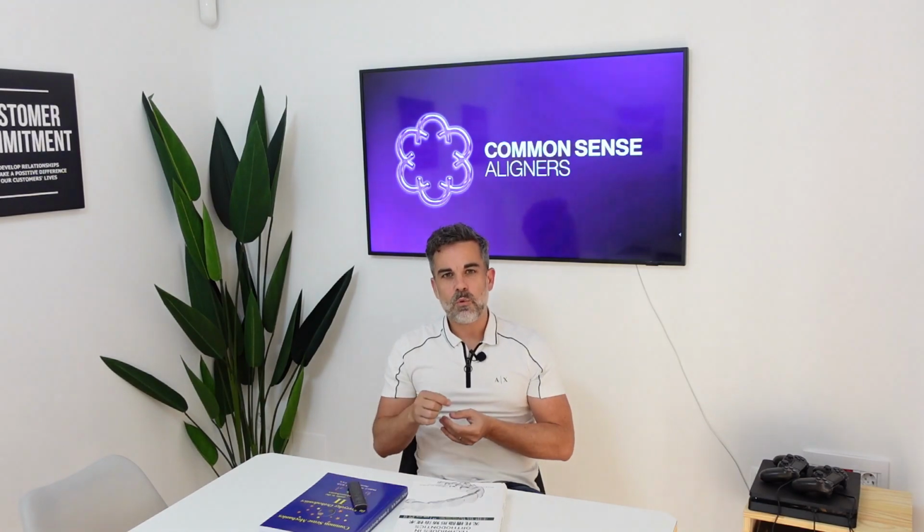In the cases in which we need a really specific or detailed approach, we might send the patient to another place, like a hospital, to have the CBCT. It is going to be much more efficient than having an average machine in our office with a great connectivity with the aligner system we're using.